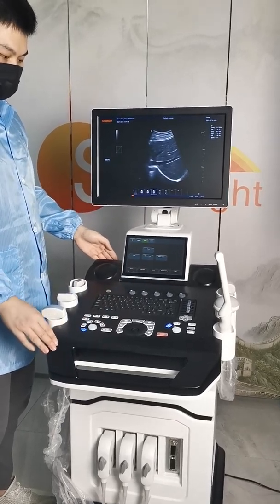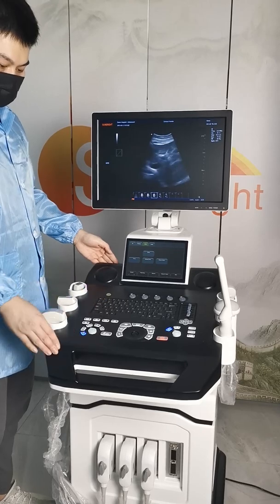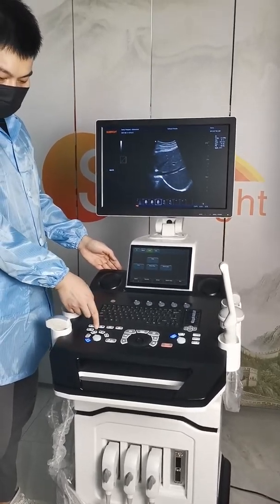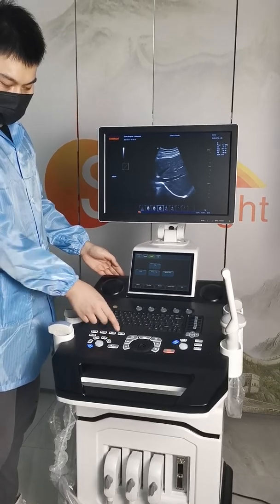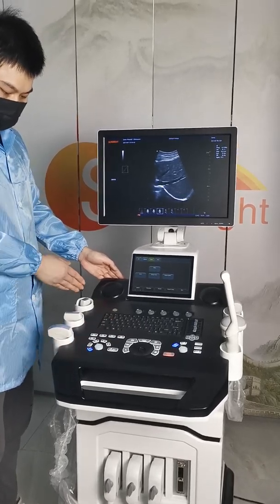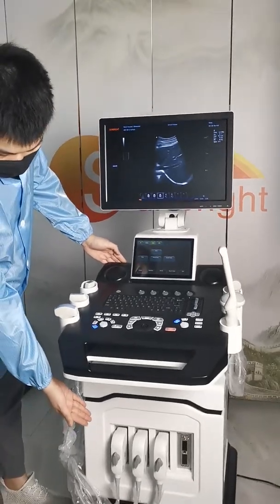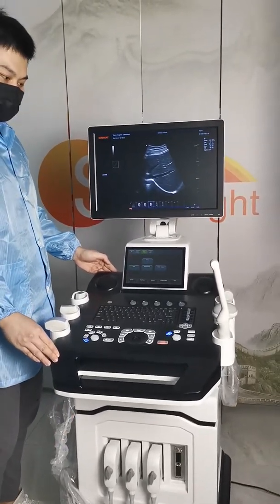Below is the keyboard. You can see we have 3D, 4D, PW, CW. It has six probe holders and four probe connectors. You can connect with four probes together.